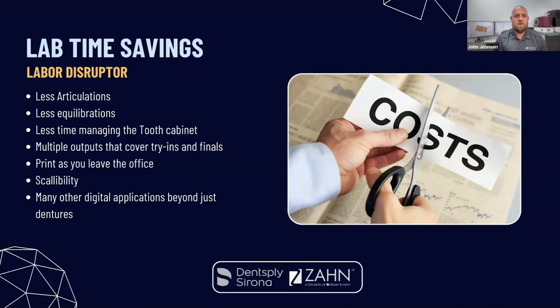As you all know, probably pre-COVID and pre-digital dentures, we used to see a lot of reps, and we used to get a lot of orders, and things have shifted, and the tooth cabinet's a big part of it. With try-ins that turn into finals, if a try-in goes out and nothing needs to be done, I am just going to my computer and pressing print and moving into final. There's no flasking it down in wax. There's no sending it over to my employee to process. There's none of that. It's going straight into its final process right away.